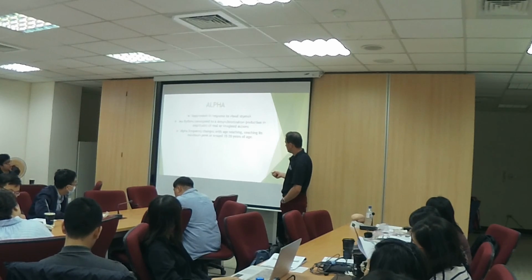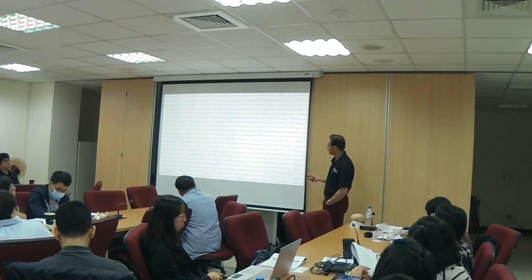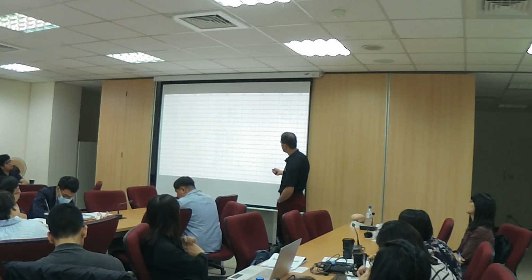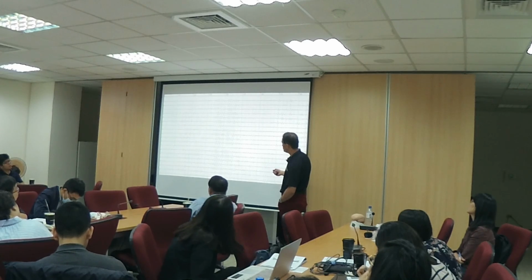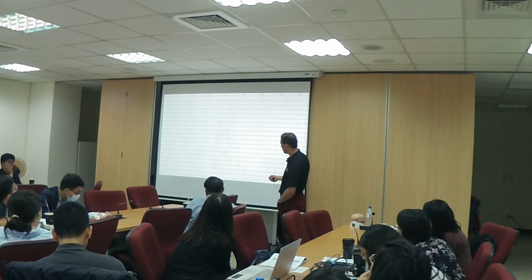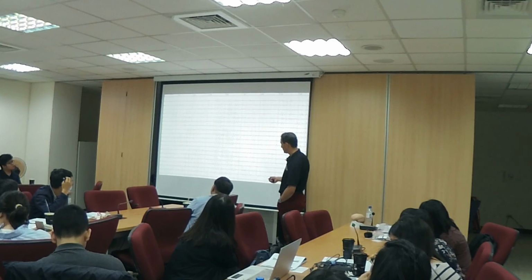And then again, the peak alpha frequency changes with age. So that's what alpha would look like in the brain. If we count, 1 second, 1, 2, 3, 4, 5, 6, 7, 8. So we got an 8 hertz alpha rhythm here. Okay? And if you see the amplitude here, it's larger in the back. So we have slower alpha. Do you see that? 1, 2, 3, 4, 5, 6. So we have a 6 hertz rhythm in the background. See that? So the higher the amplitude, the slower the frequency.